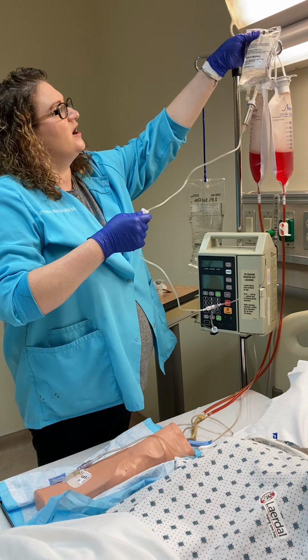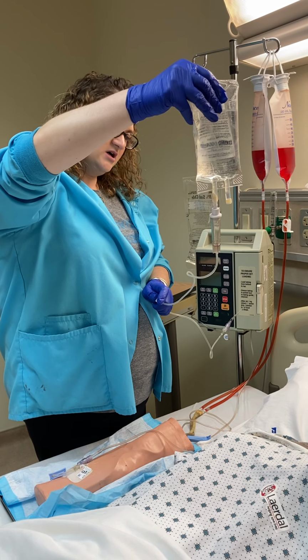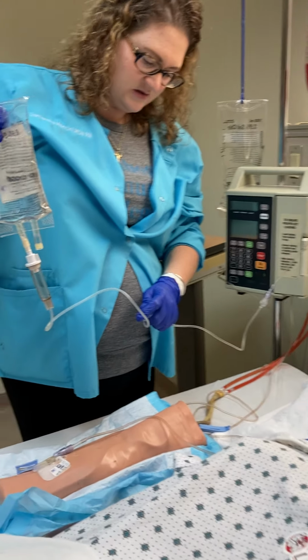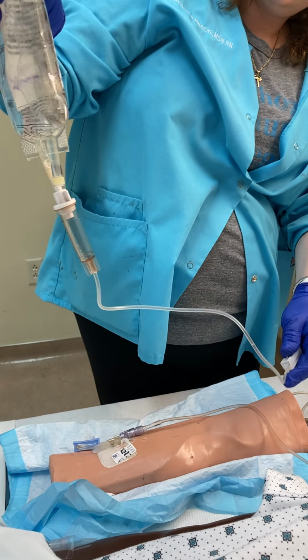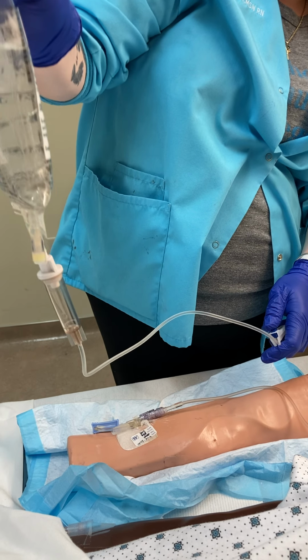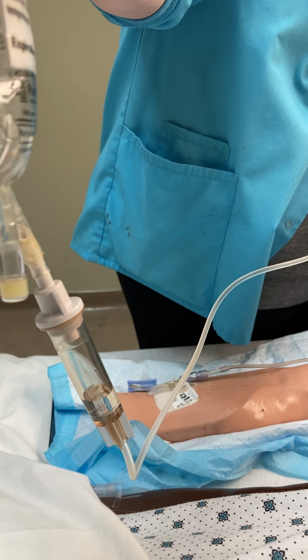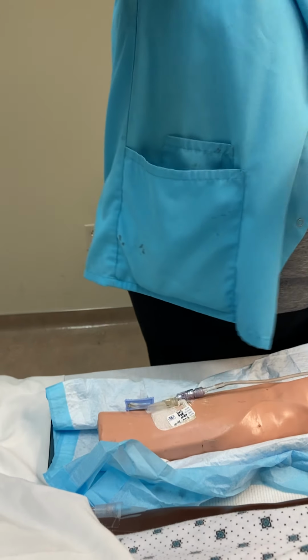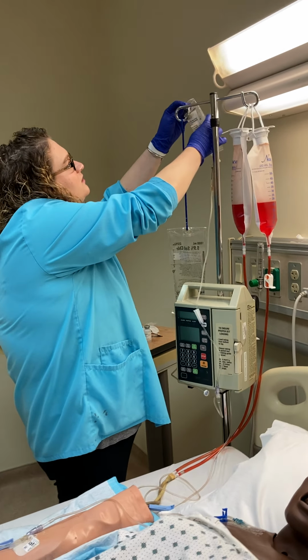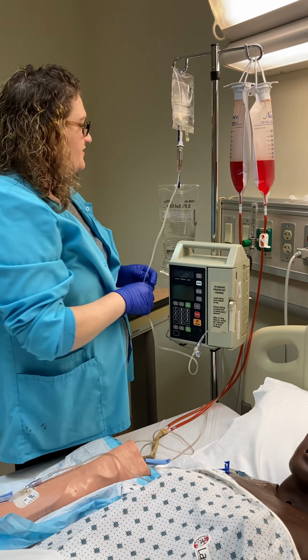And then to back prime, all I need to do is gently lower so that the tubing fills up. And you'll see there's bubbles going into the bag, and that's fine. And then you see fluid filling up in the chamber. So again, no more than halfway. Okay, I can roller clamp it closed until I get it where I need it to go. This tubing would also have the date, time, and initials on it.